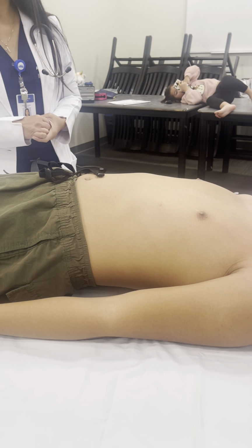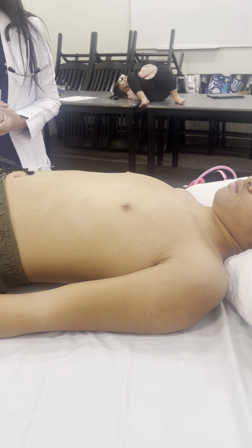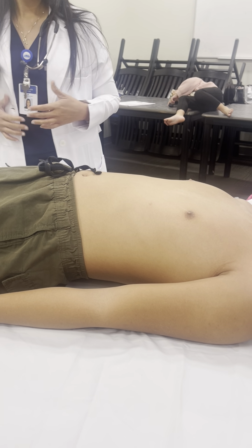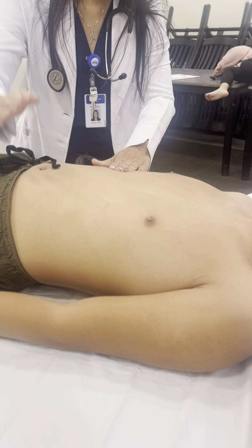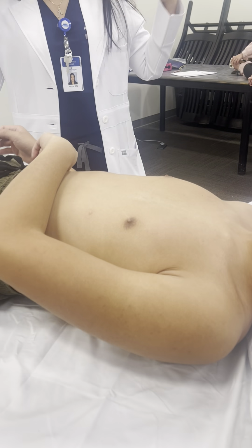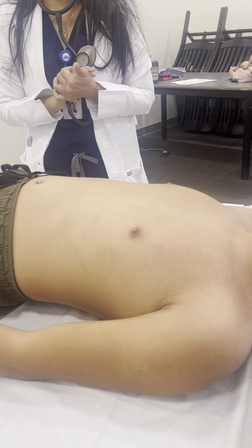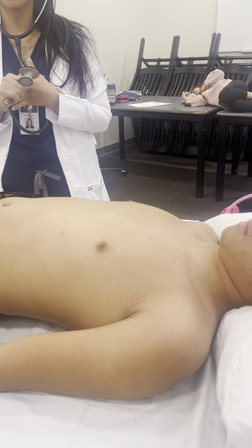Okay, next I will do an auscultation. Using my stethoscope, I will listen to the bowel sounds in each quadrant: right upper quadrant, left upper quadrant, left lower quadrant, and right lower quadrant. So I'm just going to listen. When I'm listening, I'm listening for tinkling or pinging of the bowel sounds, okay?